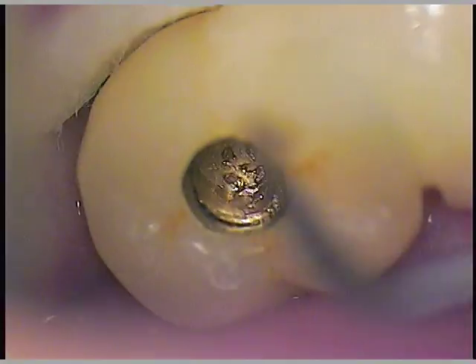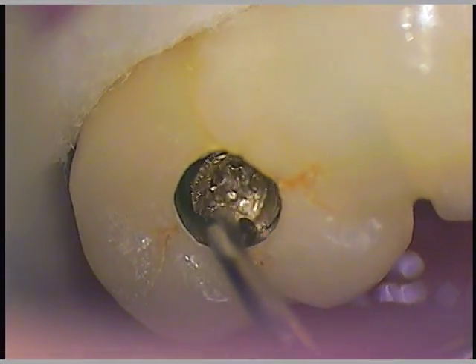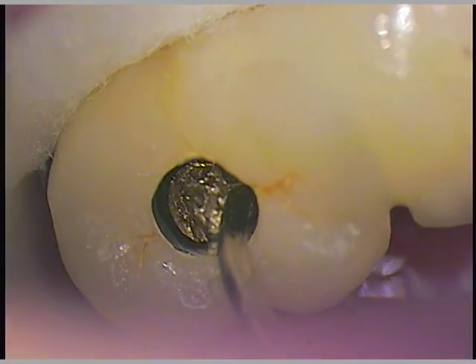You go to hand-tighten that, and you think you're tightening it, but you're not. You're stripping the top of it. So you're getting it out.